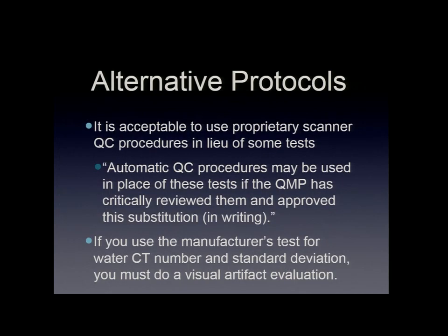And some of the alternative protocols that might be available is to use the manufacturer's method to do it. And it's okay to do that instead of just adopting the ACR's method. But if you do it, the physicist needs to be involved and needs to sign off on it, needs to approve it, and needs to verify that it's acceptable to do that.